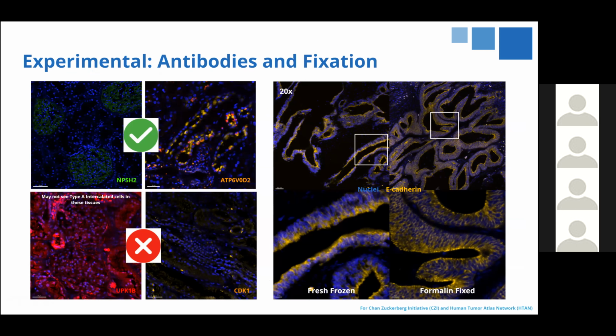Something that Jerry mentioned before was that antigen retrieval and blocking can greatly affect our staining, especially when you're designing your own custom antibodies. Akoya has a great catalog of antibodies, and there's a community source list. But for certain projects, like this project that we were working on with Jamie for Kidney Atlas, we can see the custom conjugations work really nicely.